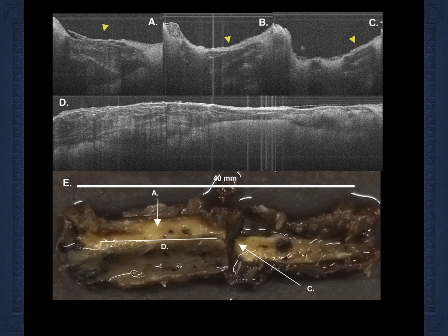Now, we had seen these cores back in the 90s, but unfortunately we didn't make much of them. I actually remember commenting to Gary Turney, who was a student at the time, that they're very artistic. So it's not like it came to us very quickly, but one of the characteristics of these cores is that they don't stay in one axial plane. They tend to rotate around, and you can see this in A, B, and C as it turns around. It makes it difficult in a longitudinal OCT scan to catch the entire core length.